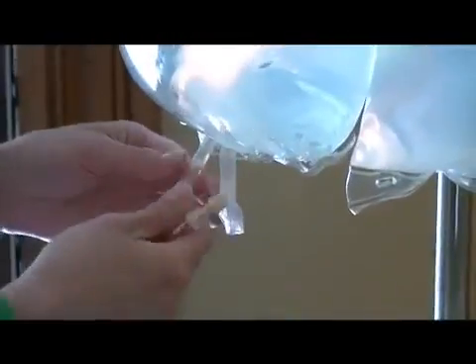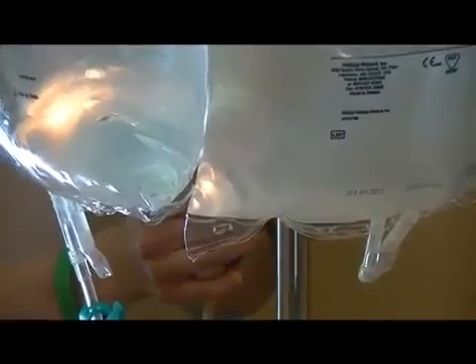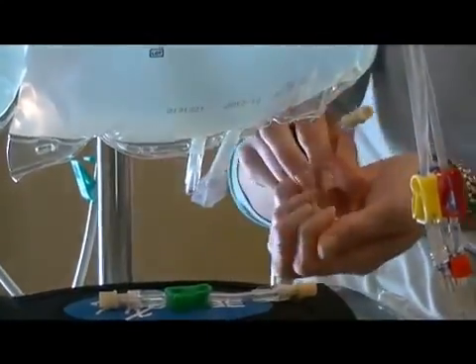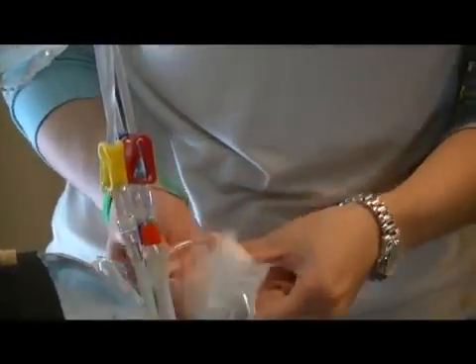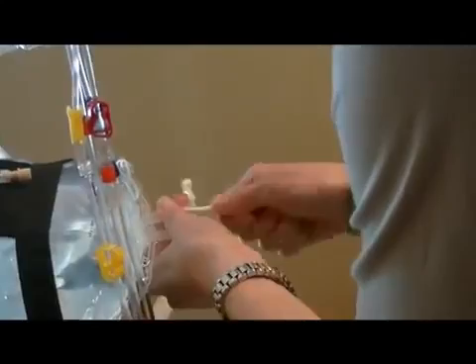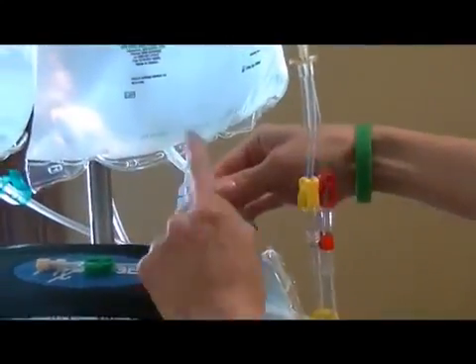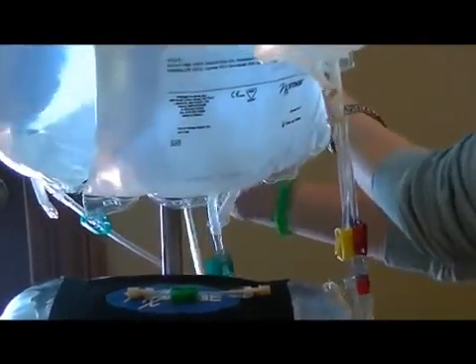Okay, then to get all these hooked together, you put this on each one of them. And then you always have an extra one because a different thing hooks to this one. So you have to bleed it off and tie it up like this, and then whenever I spike it, then you bleed it off. Then you take the spike into this one. Then all of these bags, they're not leaking now, so you have to break all of this on each one of them. So open them up.